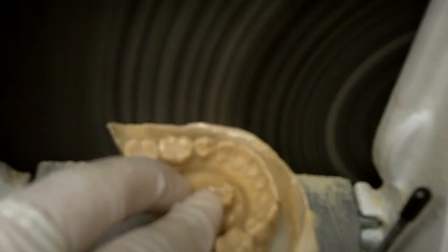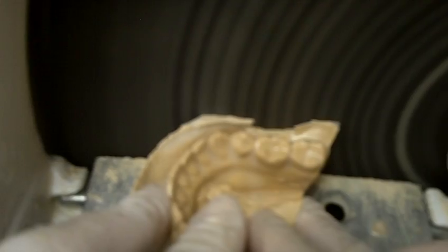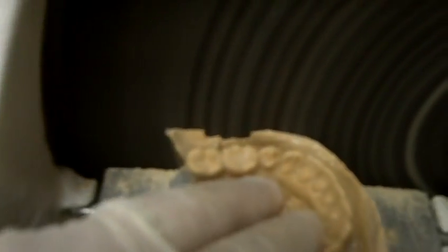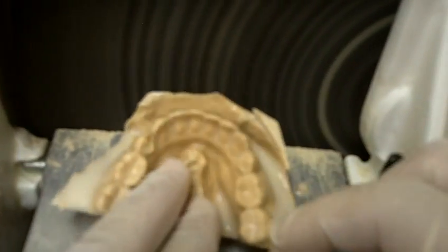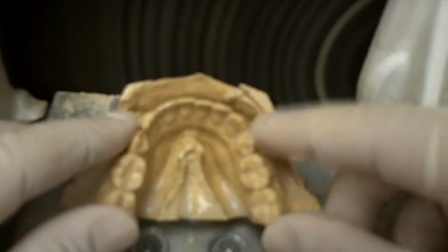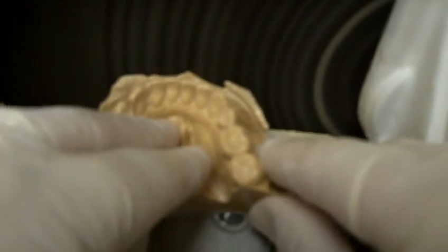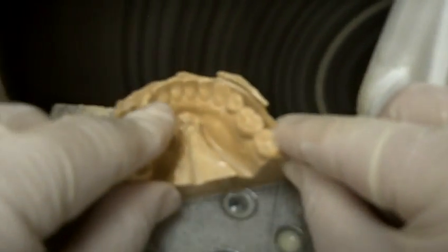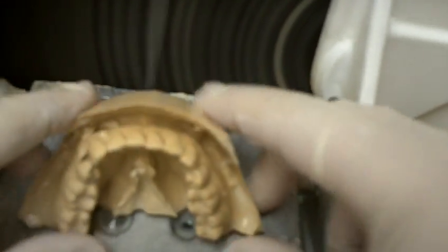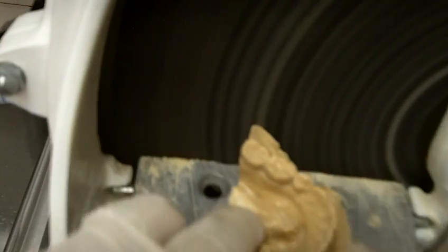Flare it. Make that point where you want it to be. Make that point. So it's here and here, which that goes to that canine, that goes to that premolar. So I want to get it more towards the premolar and the canine. Okay, so that's good. And now we'll do the heel. Do the heel.